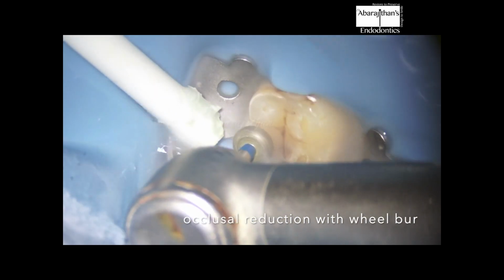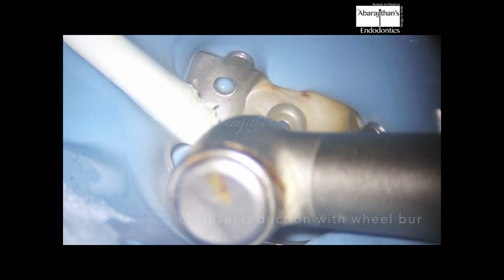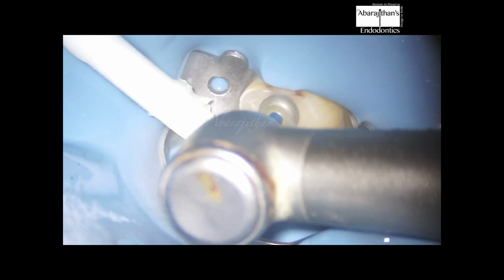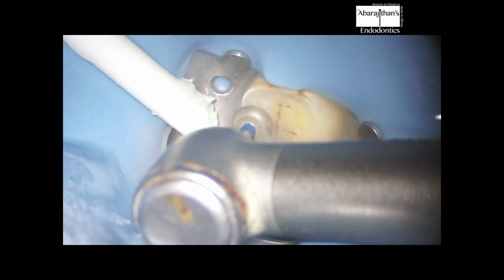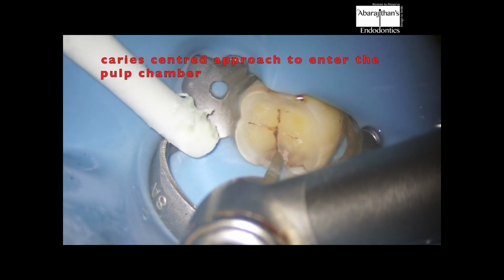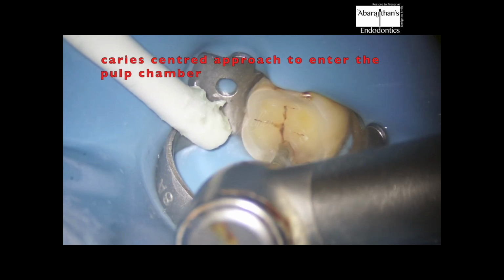It's very easy to use these wheel burrs as the axis and orientation is much simpler with the help of these wheel burrs. And since we are anyway planning to give a full coverage restoration, be it an onlay or a crown later, a little bit of occlusal reduction will be of help to give me a good occlusal table and also stable reference point.